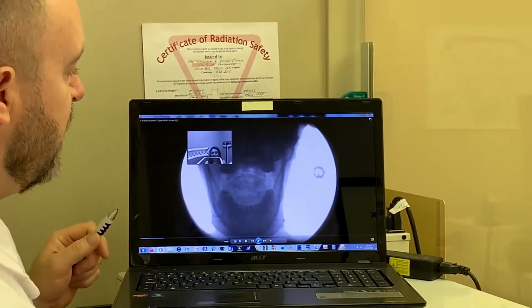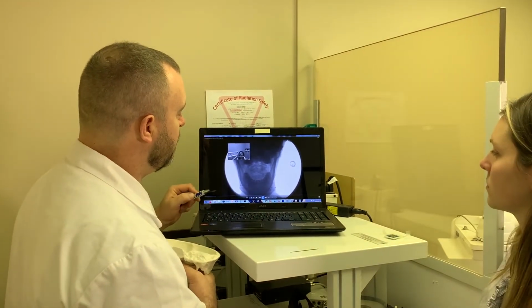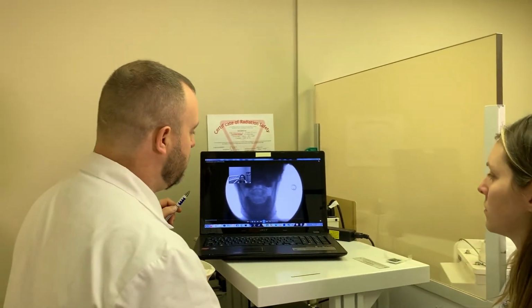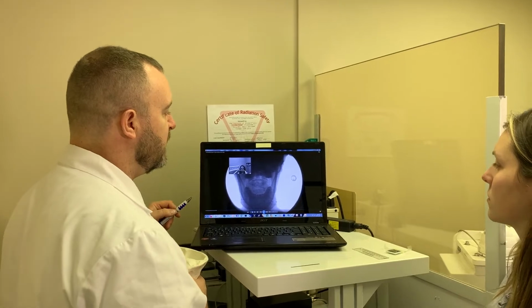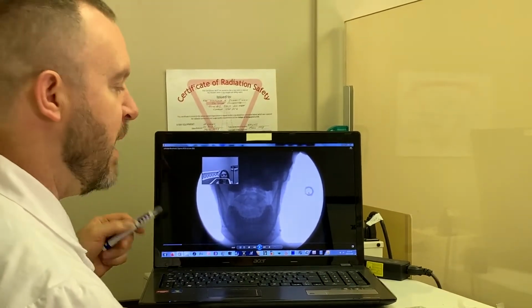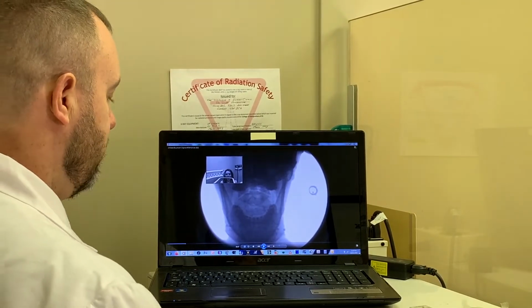And then same thing the other way, so if there's overhang or if these spaces inappropriately change so that they're not relatively equal as you get to those side bends, then that indicates the likelihood that there's ligament damage that's supposed to be preventing those movements from happening but isn't, because the ligaments are either stretched or torn. Okay?